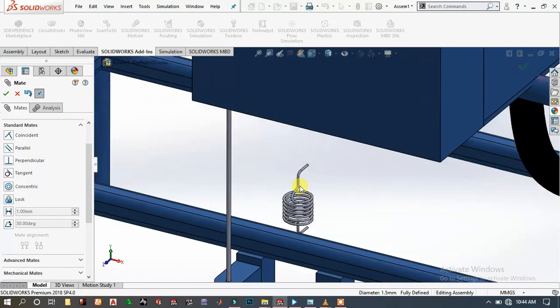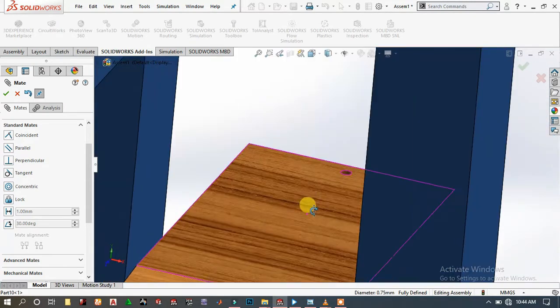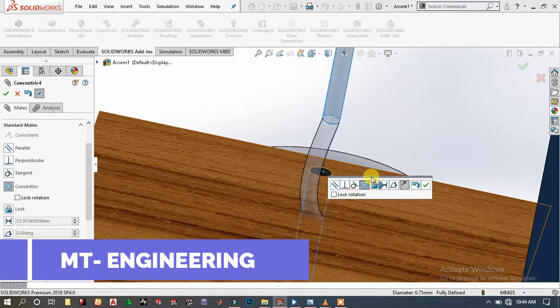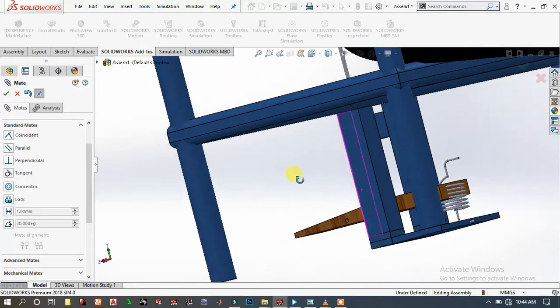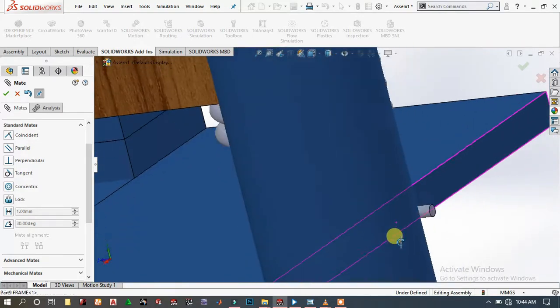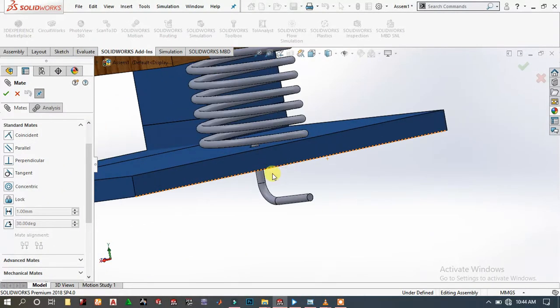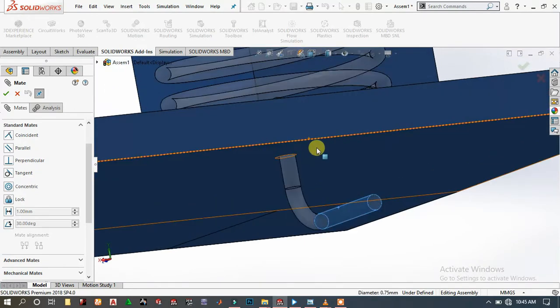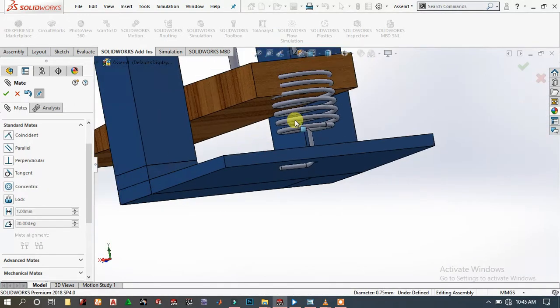Then you have to place this spring in the right position. So choose this face and the spring, then click OK. First drag this spring down, then we have to make a tangent mate here. Choose this face and this face, make it tangent, then click OK.